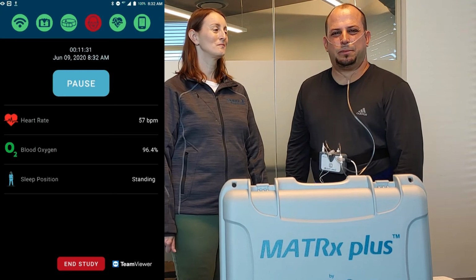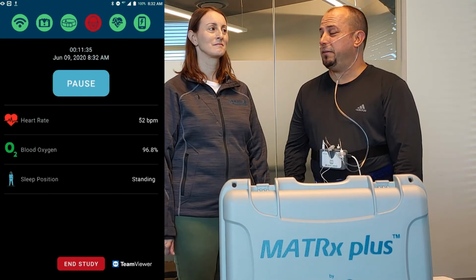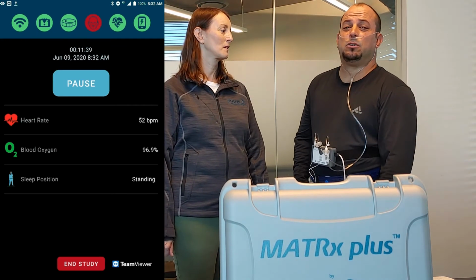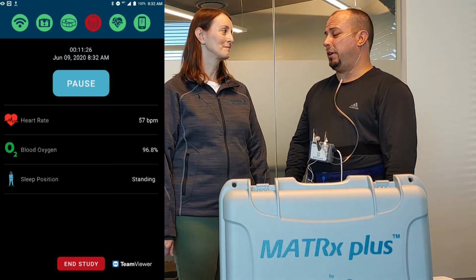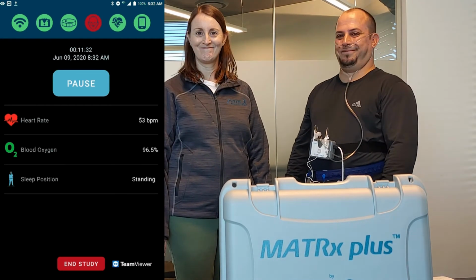Another common misconception, sometimes people feel that they can reuse their cannula, maybe even clean it, put it under some water. That's never recommended. These are single-use devices or single-patient use devices. So if there's moisture detected in it, it's probably going to give off some kind of an alert on the device when you're trying to do a study. So don't wash the cannula.